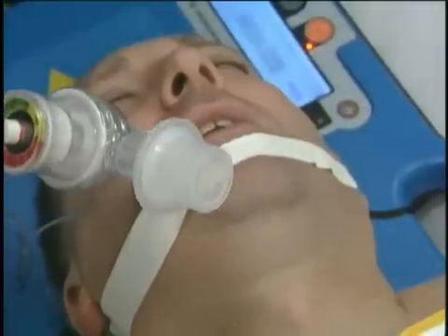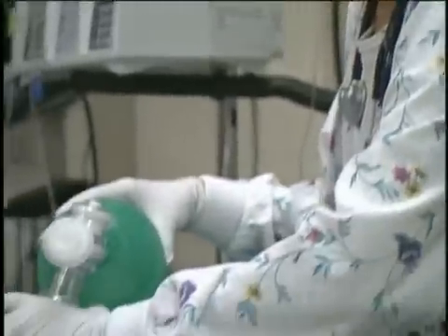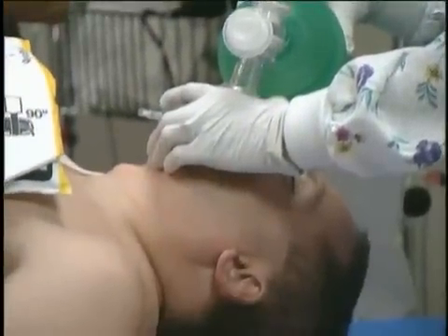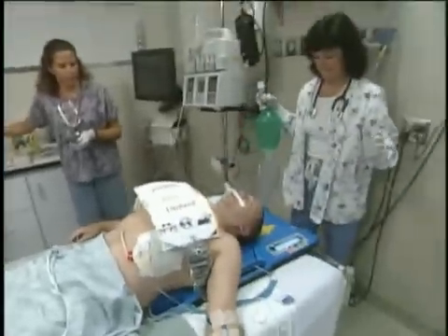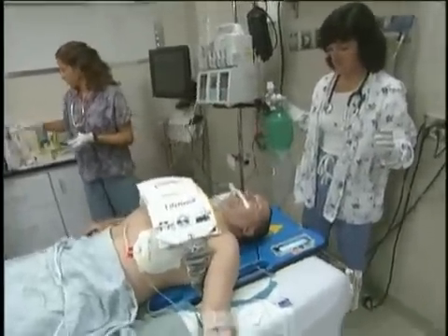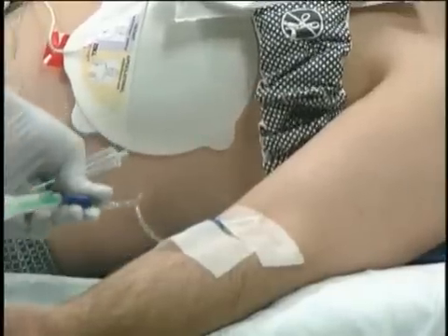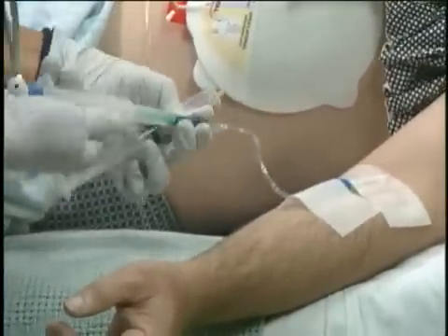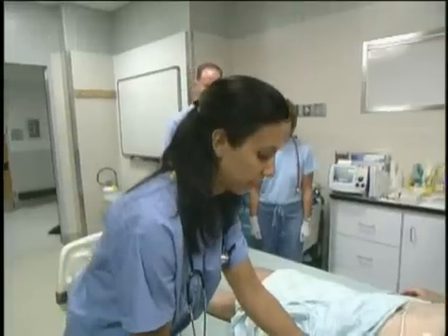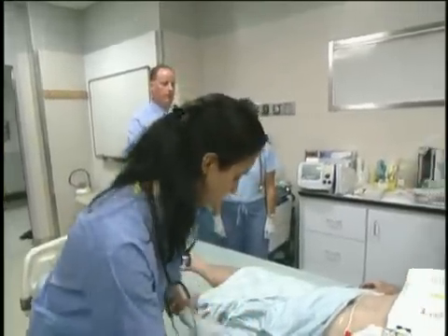Auto pulse is on continuous. We have a pulse. Do we have capnography and tidal CO2 too? Okay, we're ready. Clear. All clear. Shock at 200 joules. One milligram of epi. Let's circulate that, please. I'm giving the epi right now. Okay, is that the second round of epi or first one? First epi.